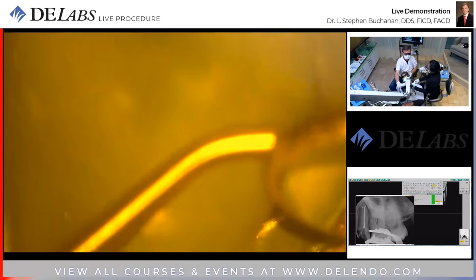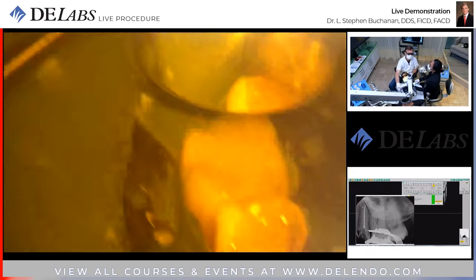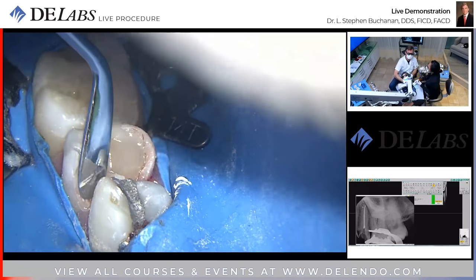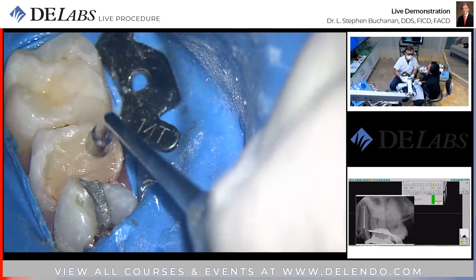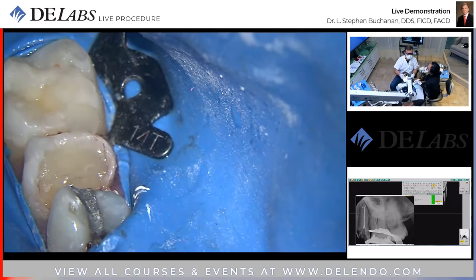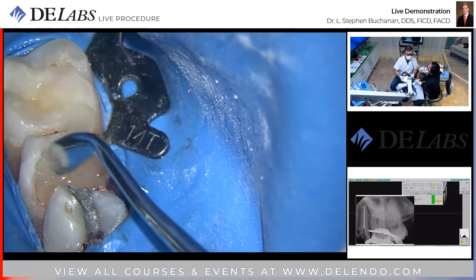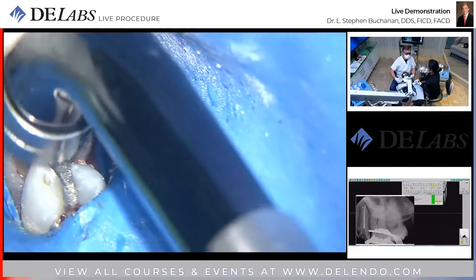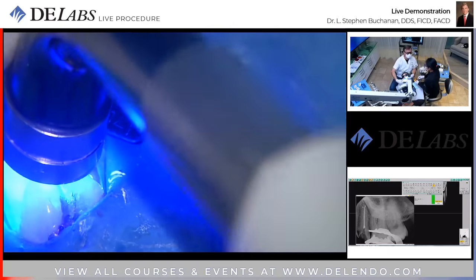To the right for me. You can lose that. Let go. Get rid of it. There we go. This stuff really is slow to cure anyway. Glass ionomer already set up with this amount of light. So you just kind of stretch it. Sorry? There's some in the distance that we can take off later. We're going to shorten the occlusion.